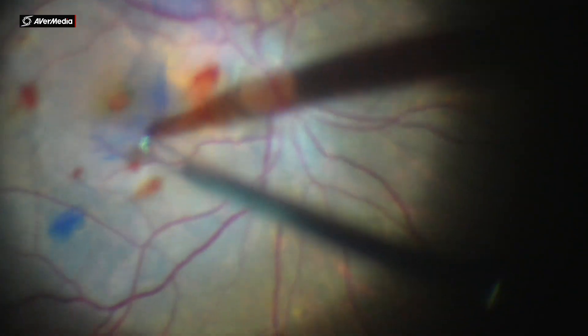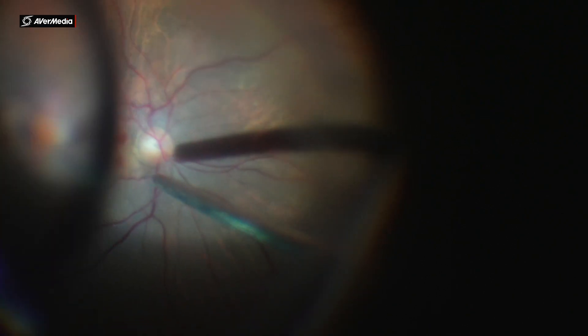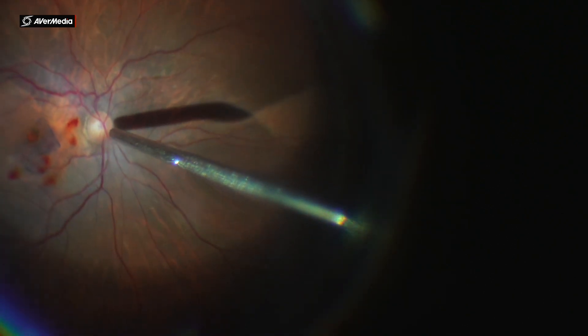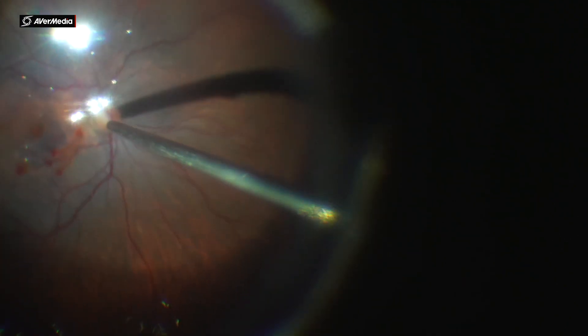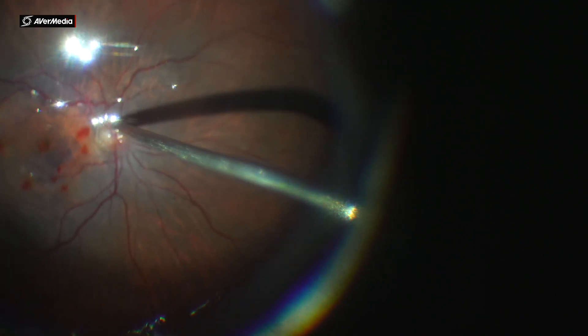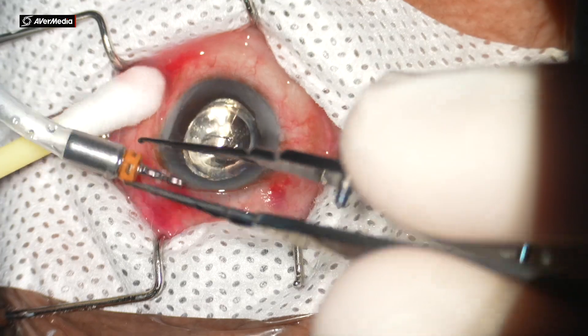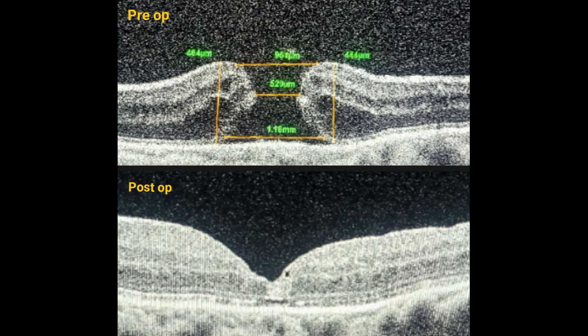A temporal flap was carefully made and inverted over the macular hole. During fluid-air exchange, the fluid was kept nasally to the optic disc as before. The case was closed under gas tamponade. Here are the pre- and post-op OCT images. The best corrected visual acuity was improved to 6/36 at one month follow-up.